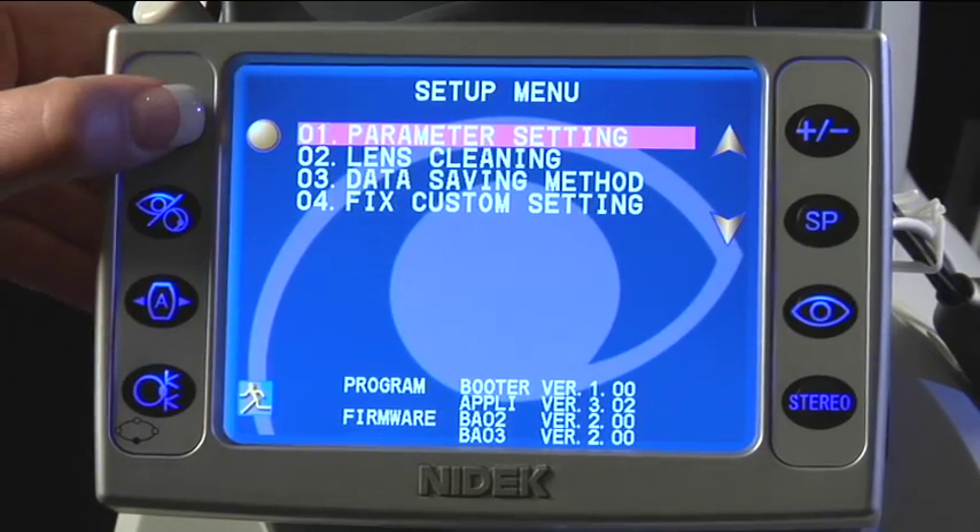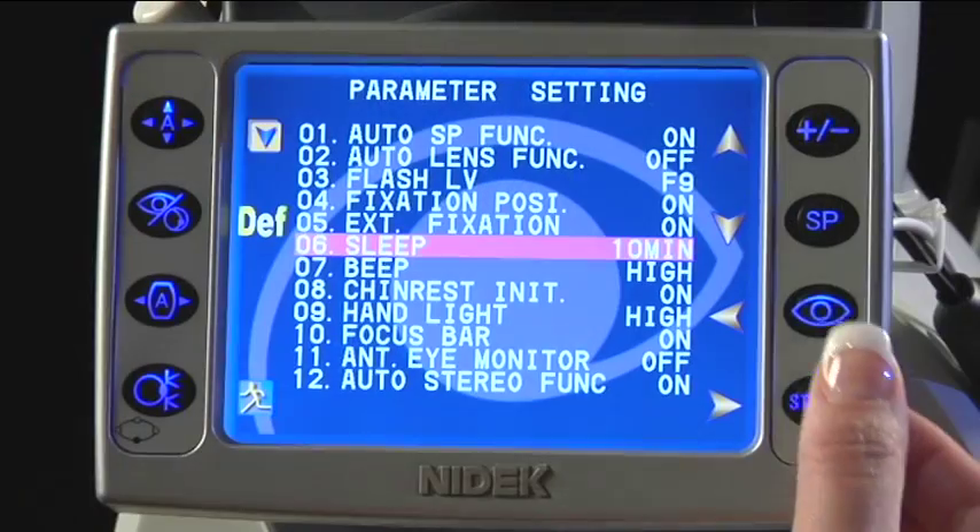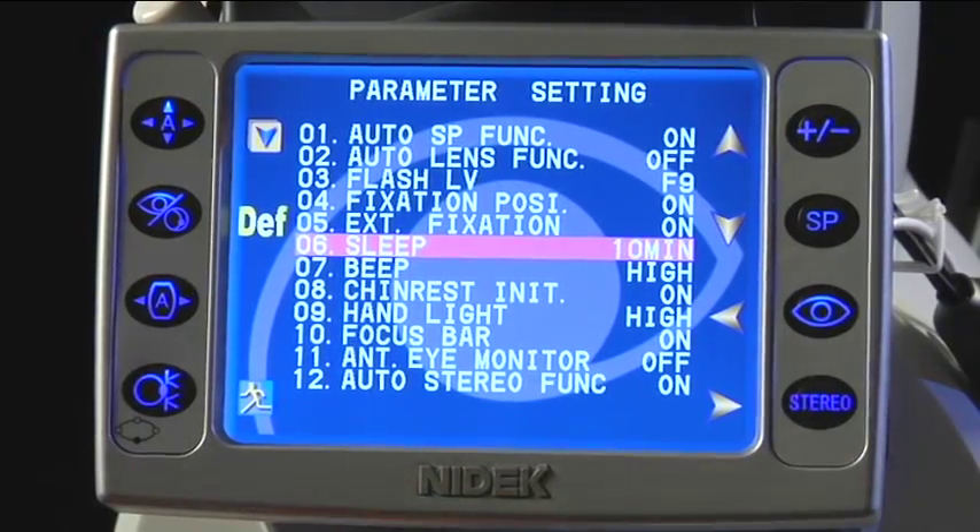The AFC can be set to go into sleep mode after 10, 20, or 30 minutes without use. This option can be changed by the setup menu.